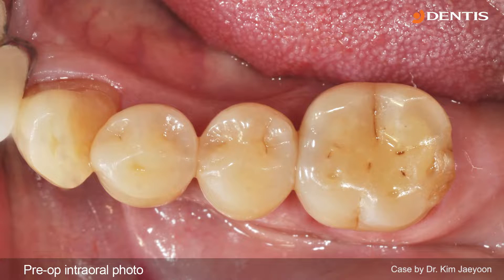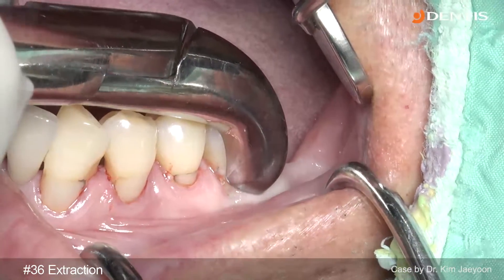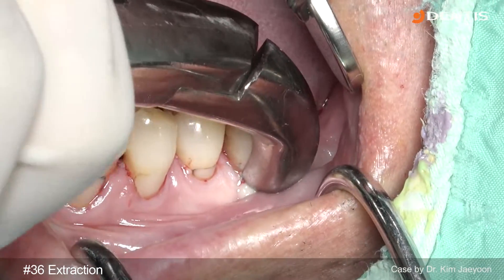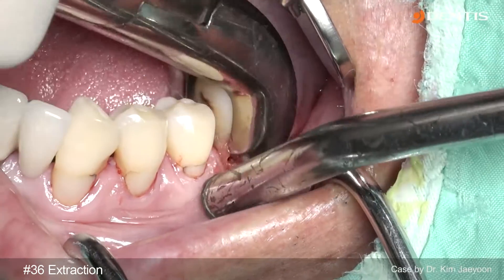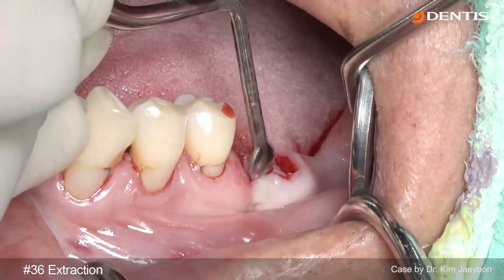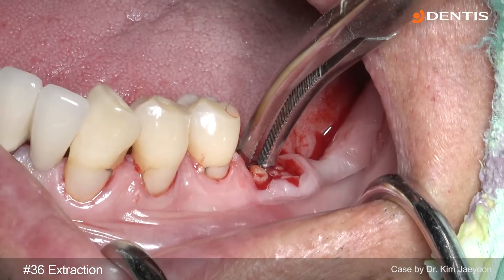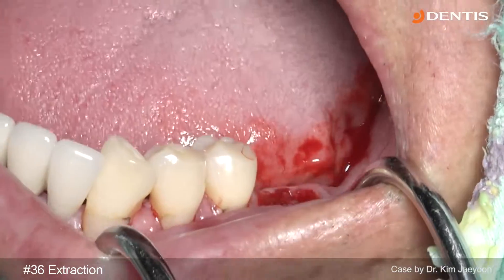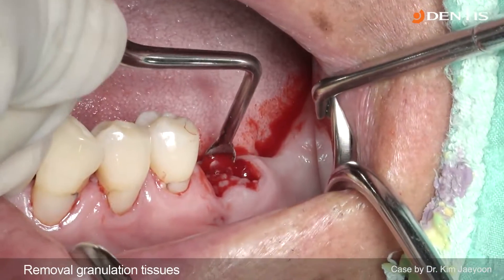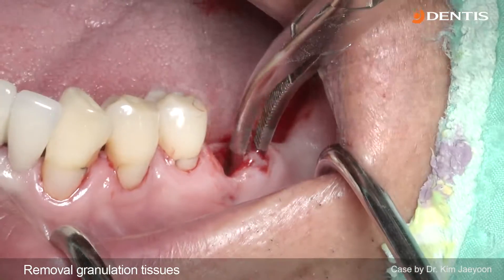This is the intraoral photo. I extracted the tooth with extraction forceps because right after the extraction I'm going to place the implant, so I removed the tooth gently without any bone destruction, as there is a vertical root fracture on the mesial side of the root.